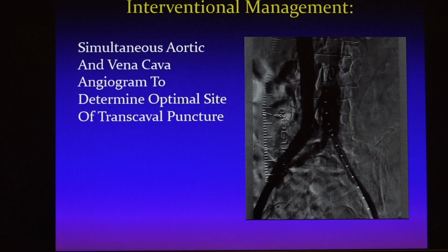As I said, there was no good access on the iliacs, but there was good enough for bailout, and that's very important to say. There's good enough for bailout at the area of the transcaval if we couldn't close it. We could go through the left common femoral artery and put a graft there.